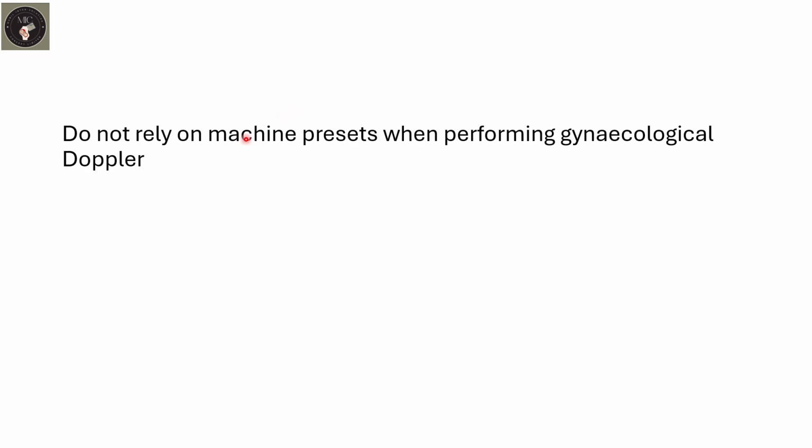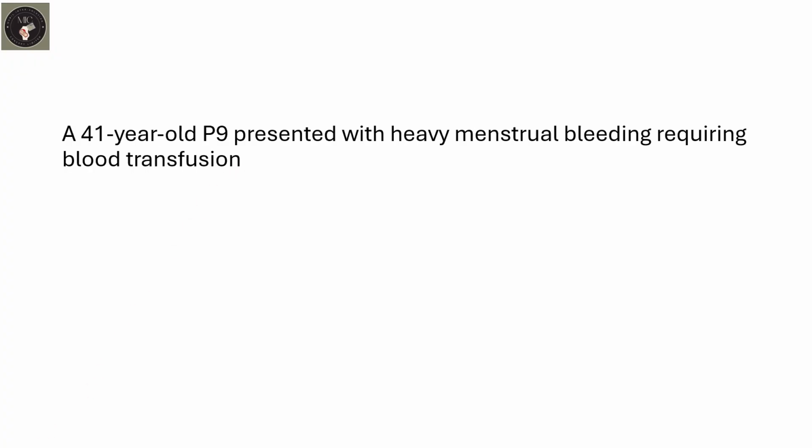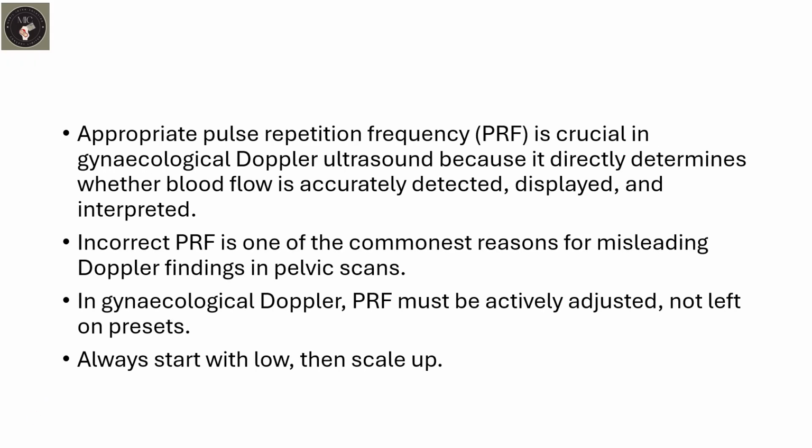The emphasis of this presentation is that there should be less reliance on machine presets in performing gynecological Doppler. The case I'm going to present is that of a 41-year-old para-9 who presented with heavy menstrual bleeding requiring blood transfusion. It's extremely important not to rely on the presets of the machine for PRF of gynecological Doppler.